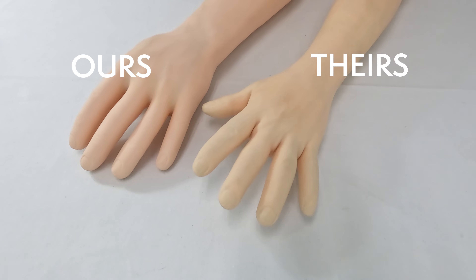Our training arm is delivered in a reusable box with a detailed setup, use, and care instruction manual. Replacement skin and vein sets are also available. The Anatomy Lab Venipuncture and IV Simulation Arm — available exclusively from Anatomy Warehouse.